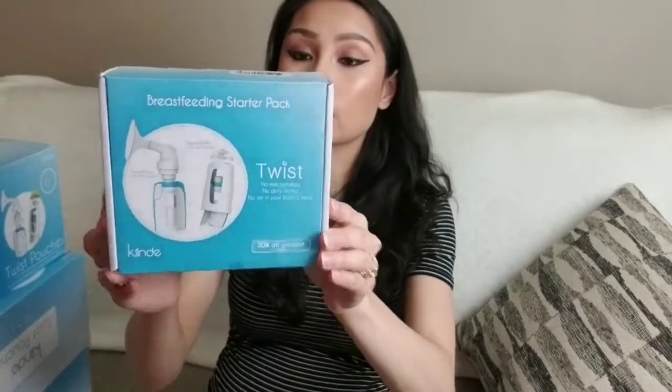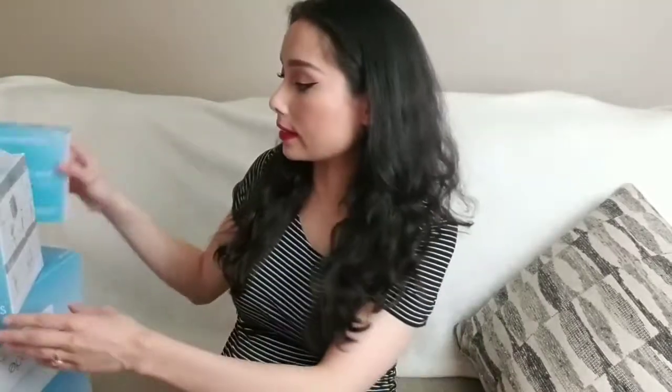Then we have the breastfeeding starter pack. They had two other kits, but insurance only covered 50 percent of those and they came with accessories like adapters, an organizer, and a bottle warmer. My friend said I'd probably never need any of that, so I decided not to pay $50 for that kit. But again, all the accessories I did get were 100 percent free through insurance.